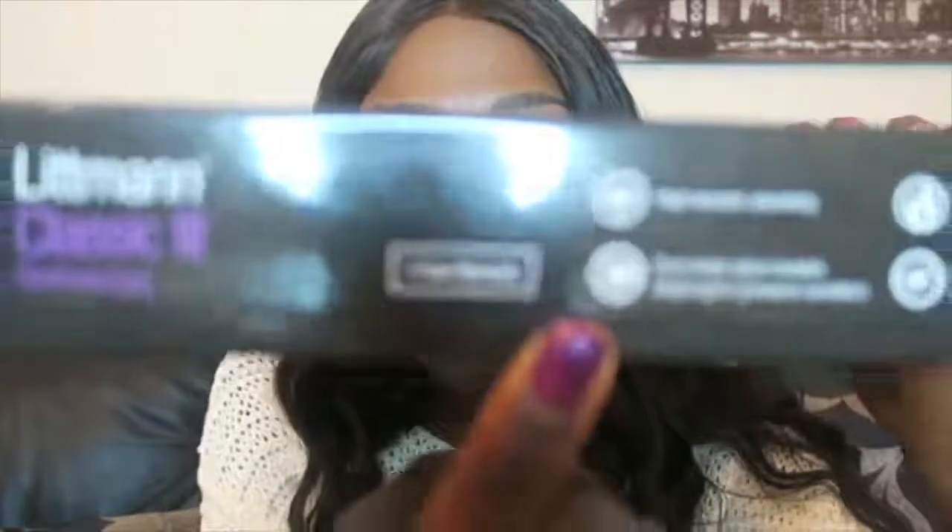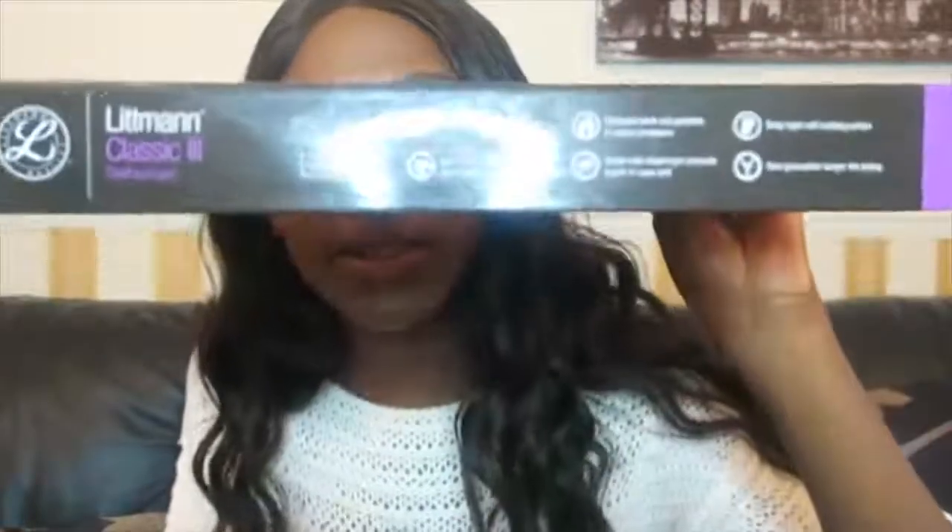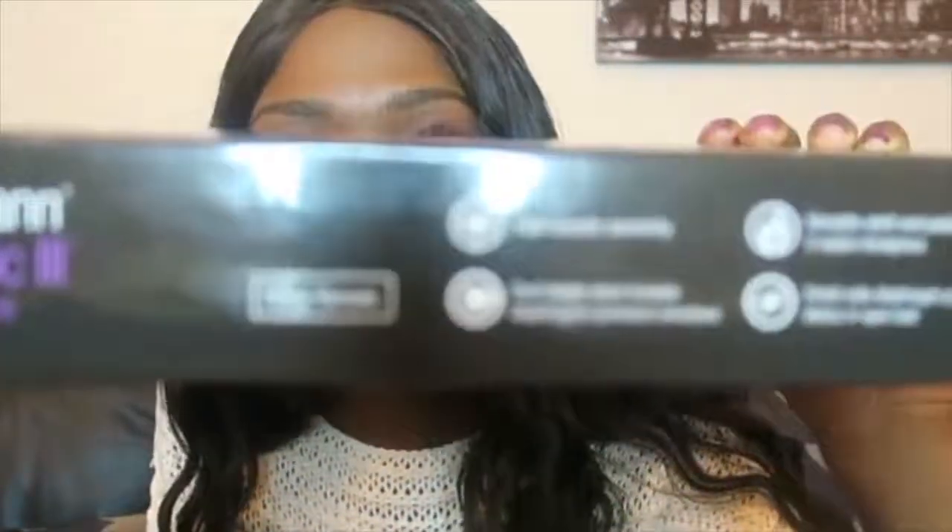Another thing I love about Medisave is the five-year warranty, which is very good. So in case something goes wrong, it's covered. It does say on the box that it comes with a five-year warranty.